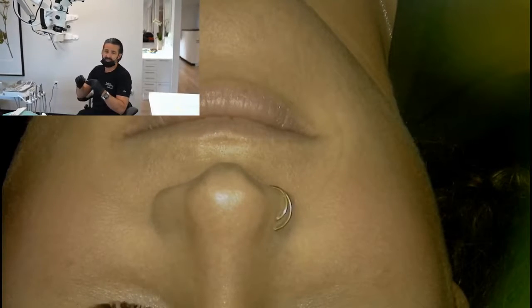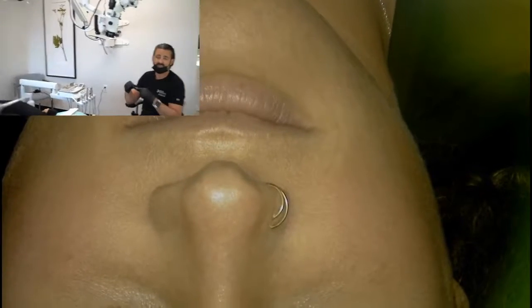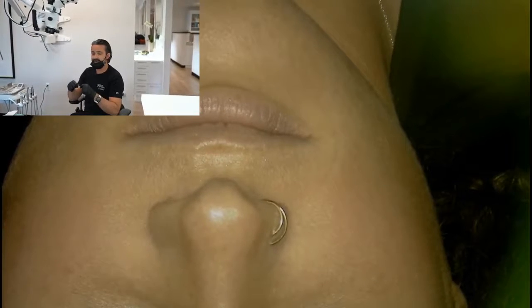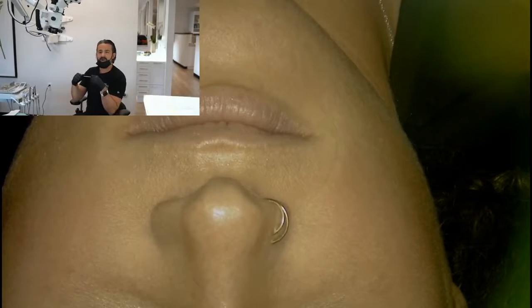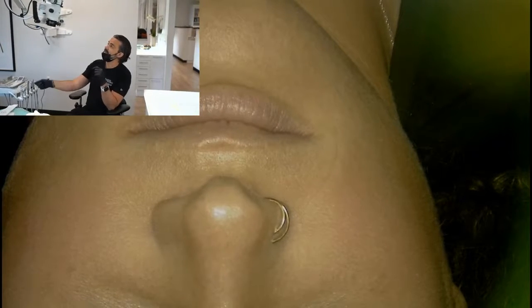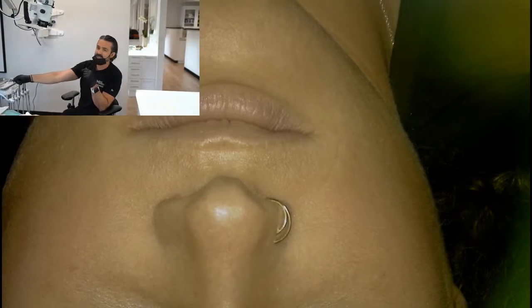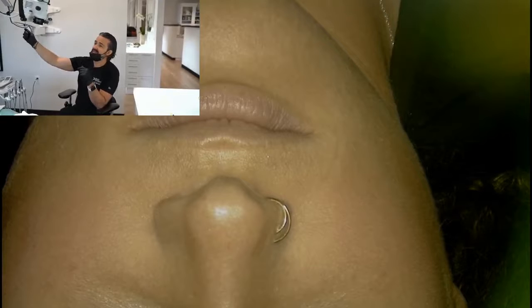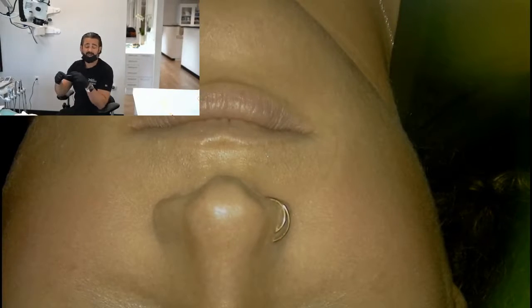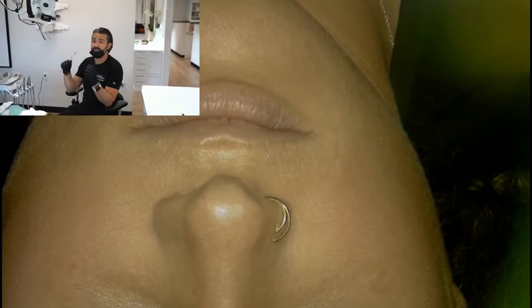I do have an associate coming in that's a left-handed doctor, so we are actually flipping the rooms around specifically for him. But that's just something to think about. If I wanted an ambidextrous room, then naturally going where this light is, or off left or right off the patient's knee spot, is a great place to go in the ceiling, because that can still work for both a left and a right-handed doctor. And 12 o'clock can work that way. It's just getting used to sort of an arm over your shoulder.